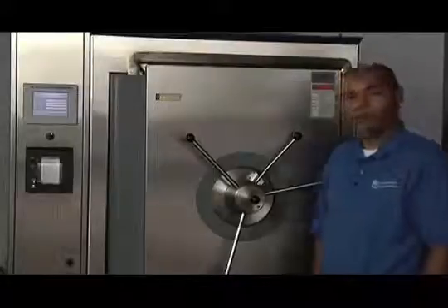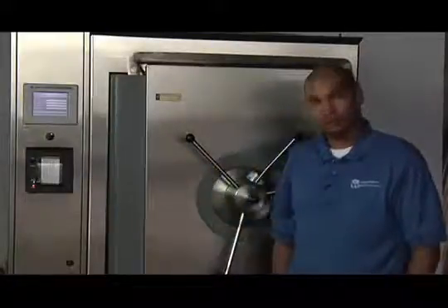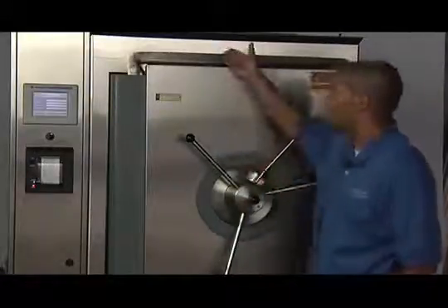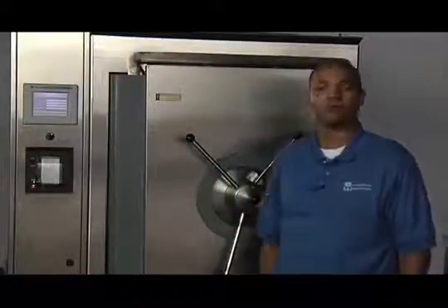It is important that you continue turning the handles past the point where the door closed signal is read on the controller. The door closed signal only informs the operator that contact has been made between the door gasket and the chamber wall. It does not indicate that proper sealing has been achieved. You must not rely on the door closed signal to inform you that your chamber has been properly sealed.